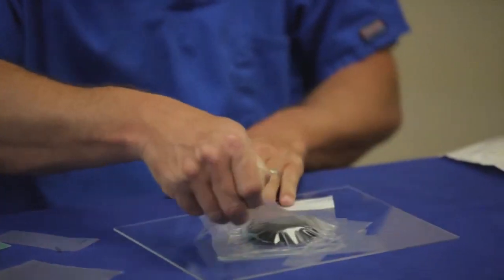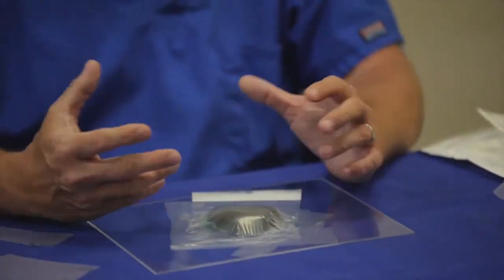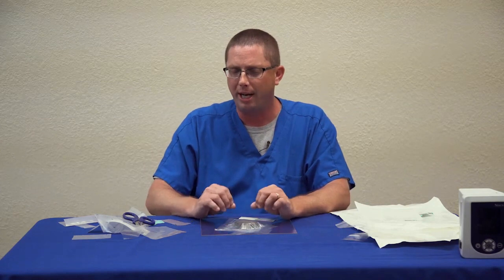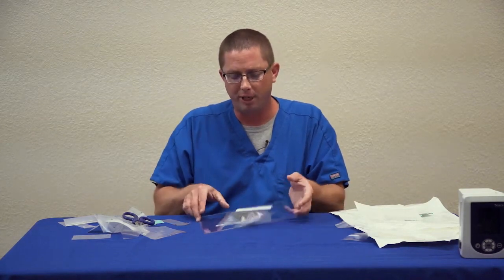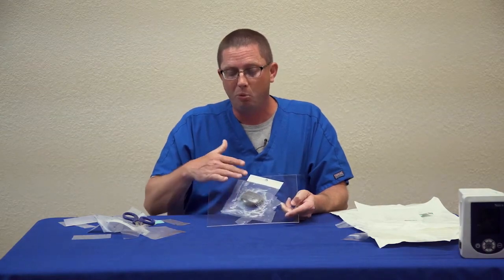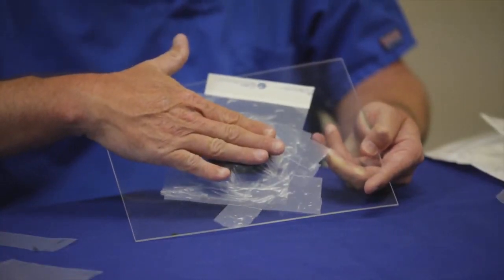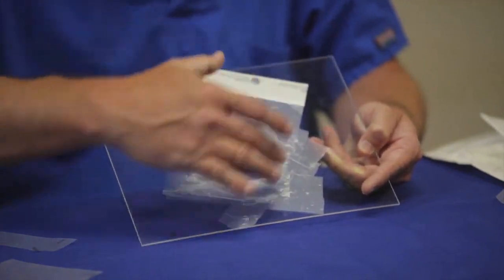Then remove number 3. And again, the wrinkles, anything along those lines will be pulled out during negative pressure. Doesn't have to be aesthetically pleasing for negative pressure to be at work and be functioning correctly. What you just don't want to do, again, do not push on the foam during the drape application. Ensure the entire wound is covered with drape.